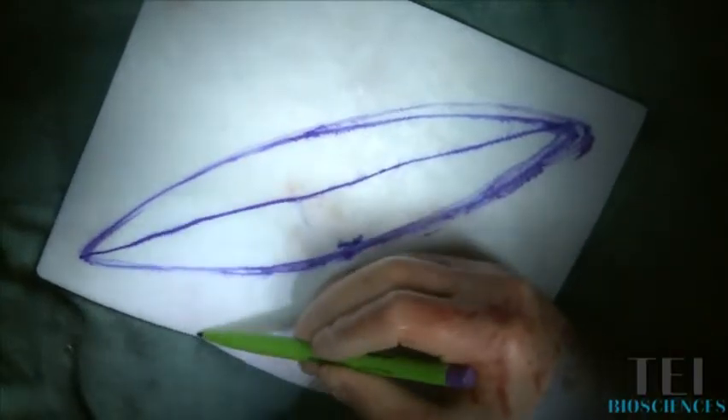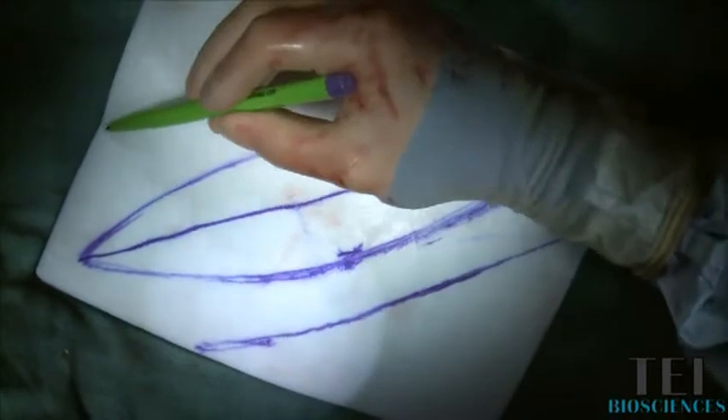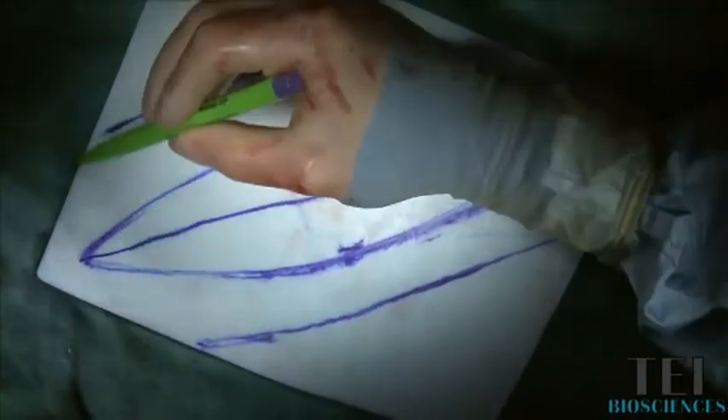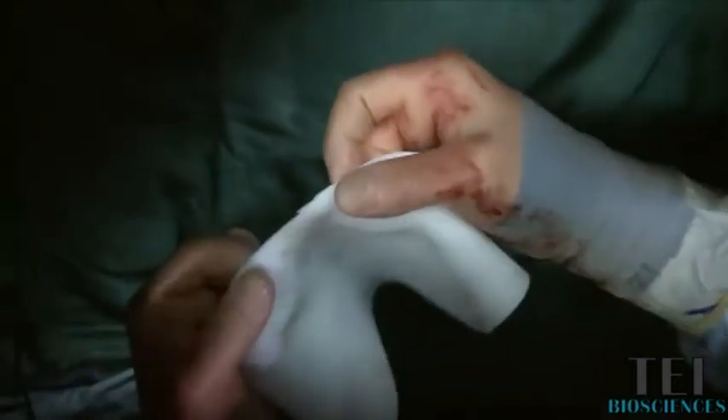You can take off the excess product around the outside so that you're not dealing with a lot of extra material. You'll notice that this material went from being very stiff to being quite pliable, but it's still quite thick — this is a three millimeter piece. It holds the suture very well and it doesn't tear at all.